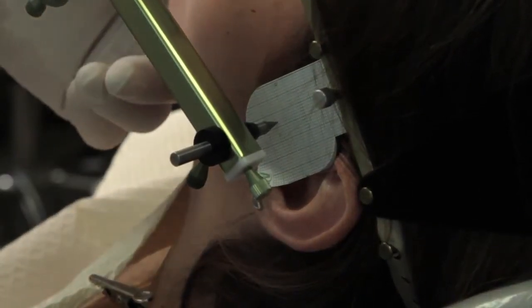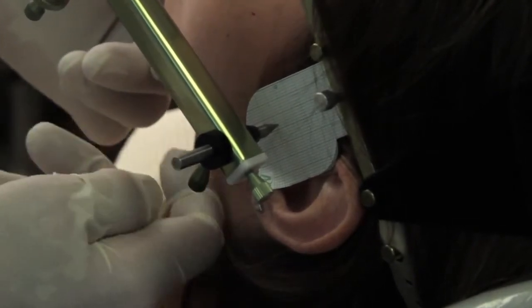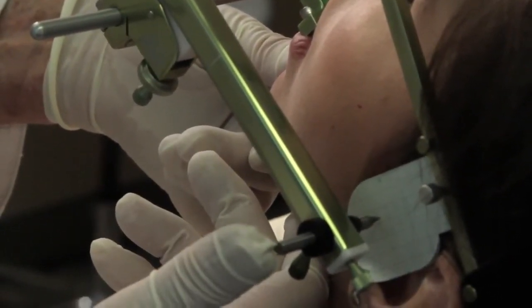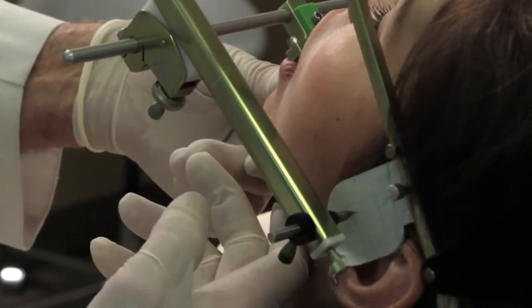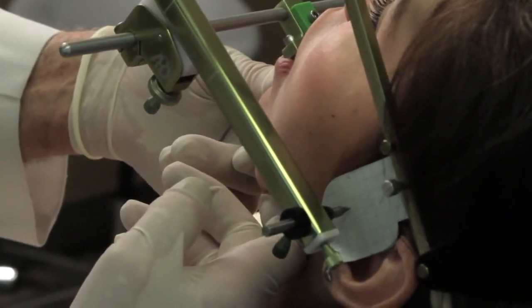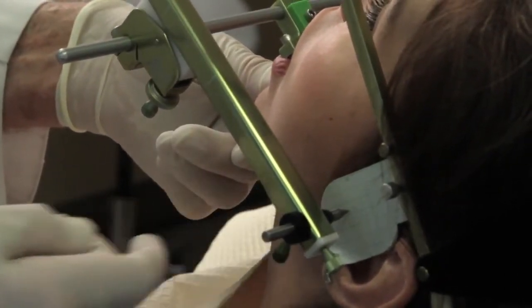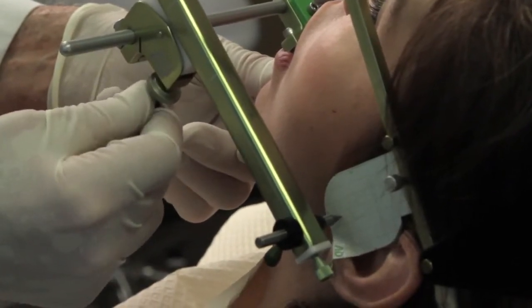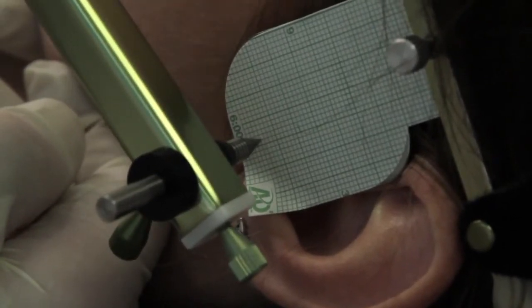To do this, I'm not pushing or anything, I'm just feeling at pogonion, and I'm going to put my index finger under the gonial angle, and I'm going to put a slight lift on the gonial angle, and I'm going to reach up and touch the stylus pen with my thumb, touch it against the flag, and then remove my finger. And then I'll ask the patient to open slowly and to close. Now, I'm going to exaggerate it because you got to be able to see it. So I'm going to move the stylus pen quite a bit so that you can see the exaggerated curvature. Okay, now open again, please. Close.